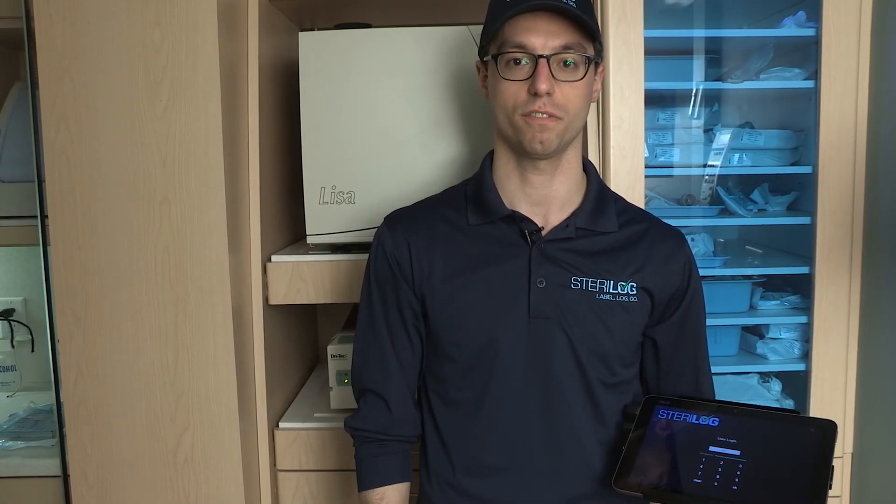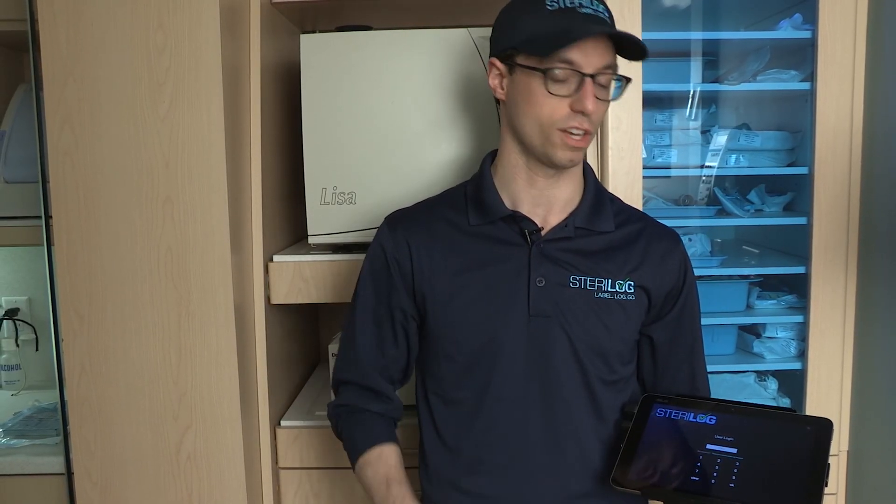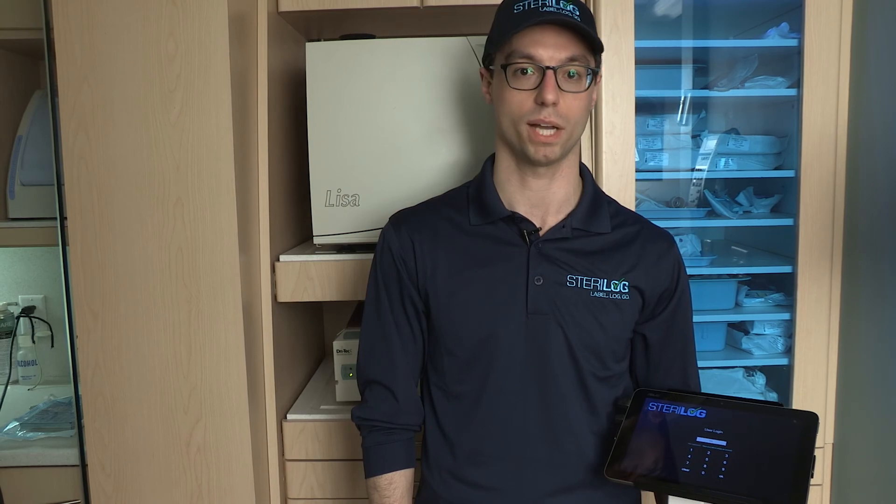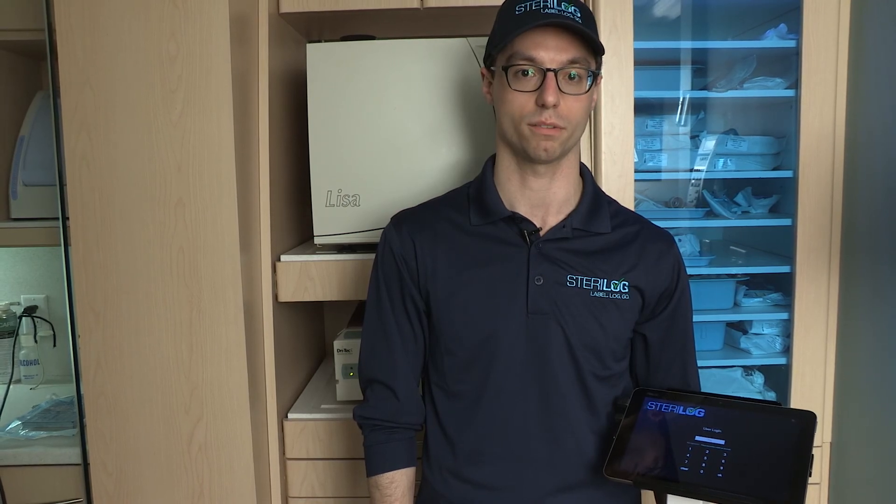Hey guys, in this series of videos I'm going to walk you through the setup of your SteriLog system as well as the process of labeling and logging your sterilization cycles, as well as signing off on your chemical and biological indicators.